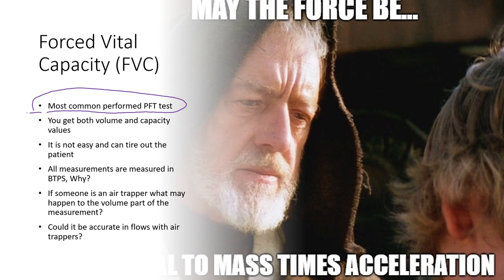It is not an easy test, and the patient can tire out pretty easily with this. So you've got to be careful of that situation. When we're looking at this test, we do need to be sure that if they do start to tire out, that's something we record for the record. That way the physician can interpret this as well, knowing that they were fatiguing with the procedure. So they might have to reschedule the procedure if they want more accurate values, if we can't get reproducible results.